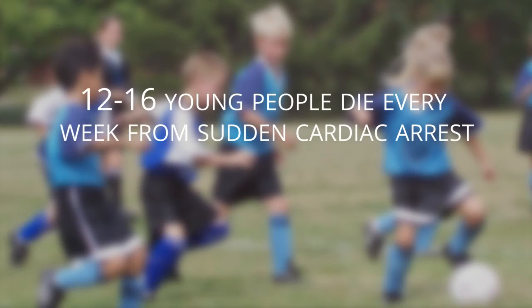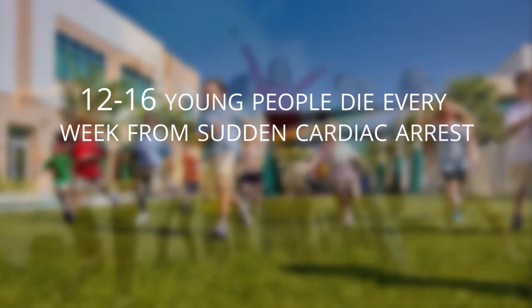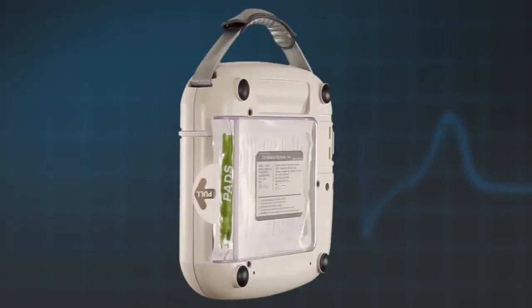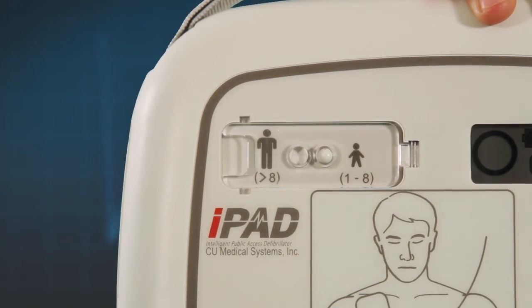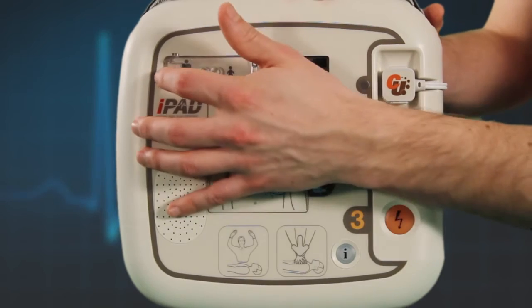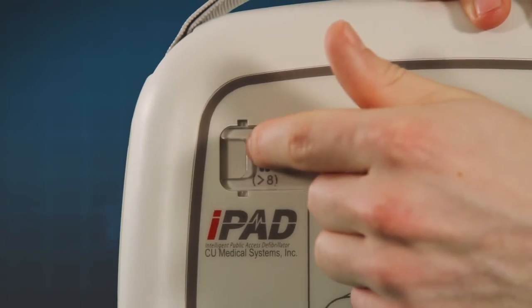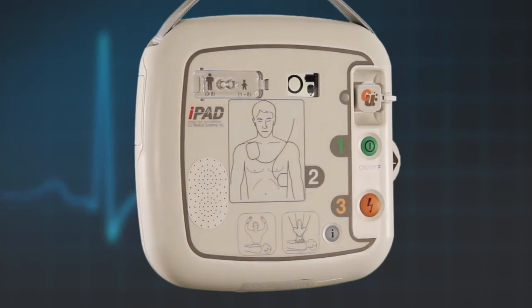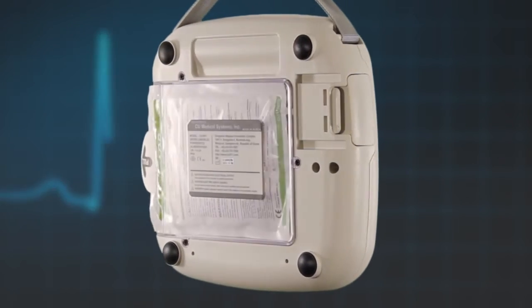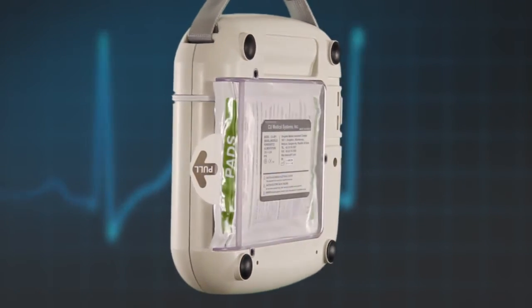Whilst the majority of cardiac arrests are on casualties of adult age and the incidence of cardiac arrest in children is rare, they are on the increase. The iPad SP1 AED has a feature that allows it to be used on children should the need arise. There is no need to change the pads — simply lift the cover and slide the switch on the front of the AED to select child mode. The iPad SP1 AED holds a water resistance rating of IP55 and has passed drop tests to all sides and corners from 1.2 metres.